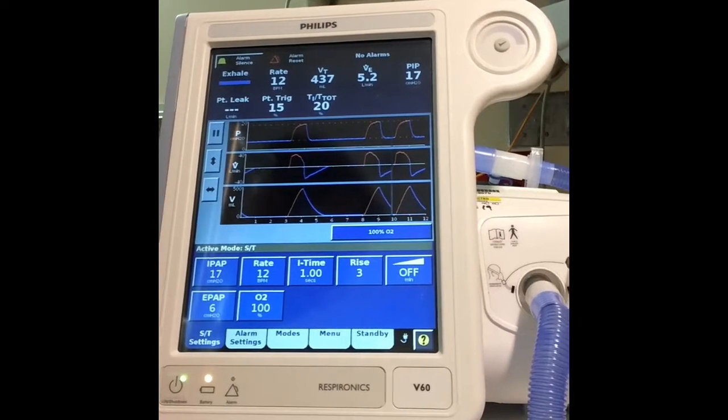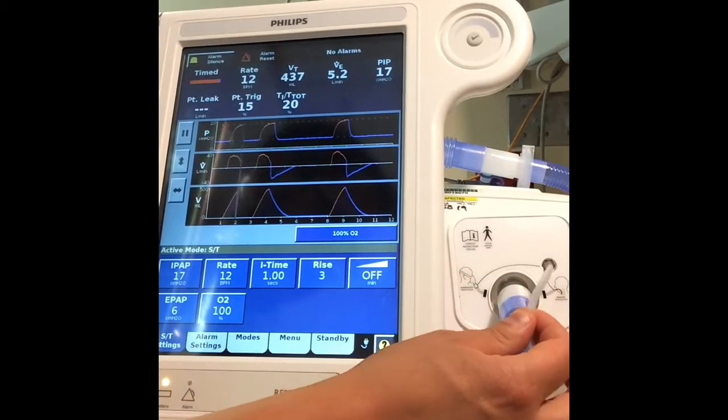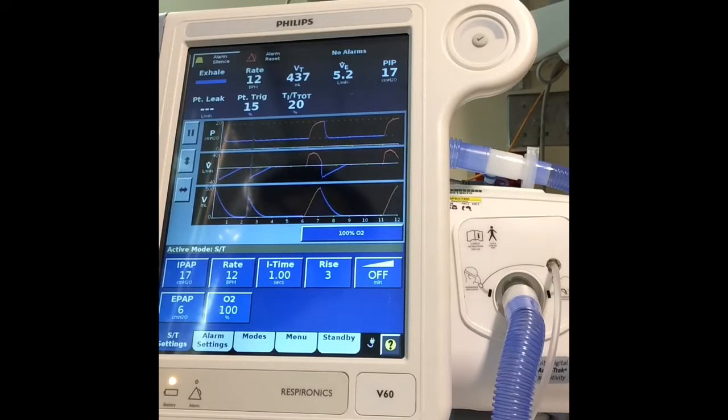There's this little tiny tubing right here that connects up here, and there's another one that connects by the mask. If that gets unplugged, we get that proximal line disconnect. Also, we get that high pressure alarm. We get that because the patient's coughing or talking. Those are the two most common ones that we see.